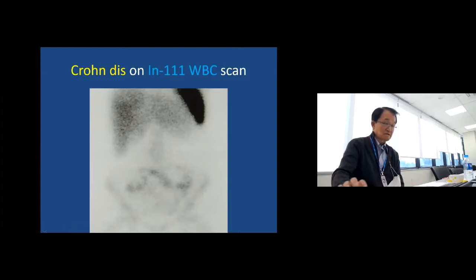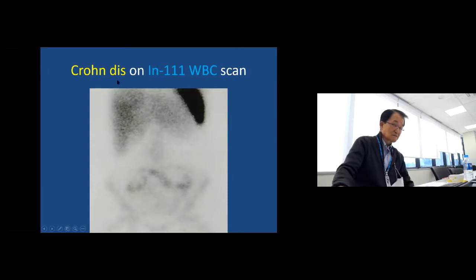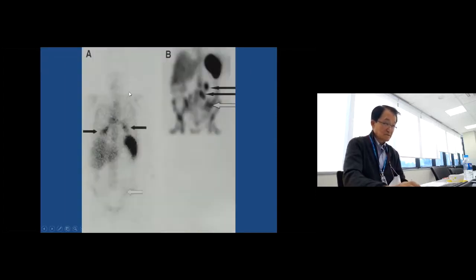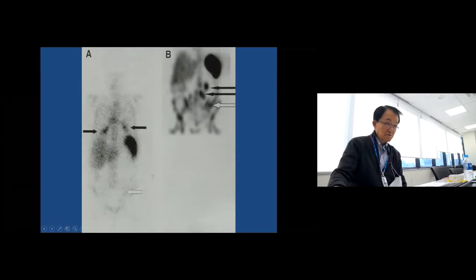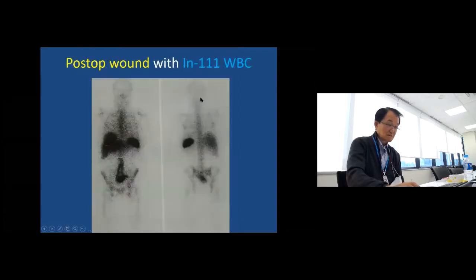In England and other countries, this leukocyte imaging has been used to monitor patients with chronic Crohn's disease or ulcerative colitis after treatment. Nowadays, SPECT CT is much more useful to localize precisely the abnormality and characterize it, and detect additional small lesions on CT or MRI, such as increased activity in the hilar, perihilar region. SPECT also shows retroperitoneal lesions.